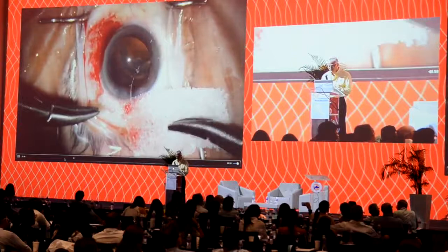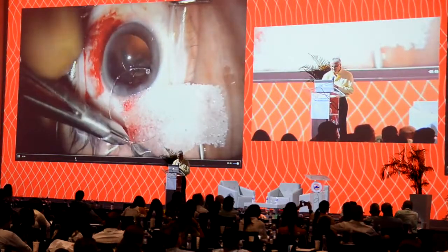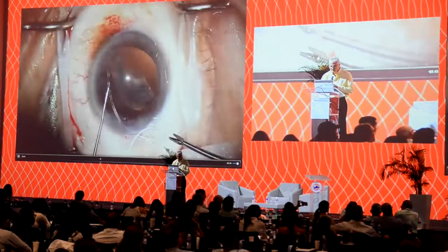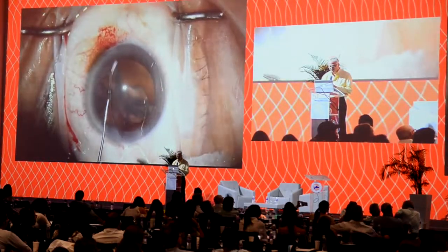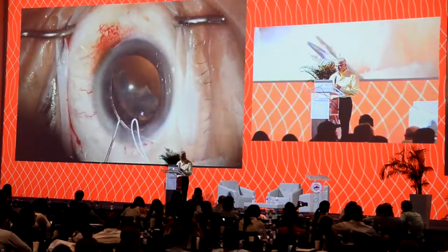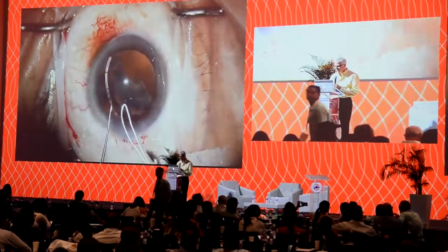We're about halfway there. We'll make another couple of bends around until we get the ring to a more amenable size for us. I won't bother you with each of the little bends, but we'll zip forward a little bit further. Then we place this ring in. You notice that we've got the equatorial capsular material out. There's still some epinuclear material. Ken Rosenthal, I like to quote as having said that we should put in a ring as late as we can, but as soon as we must.